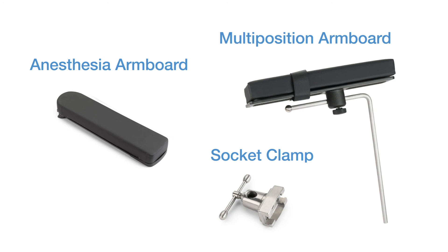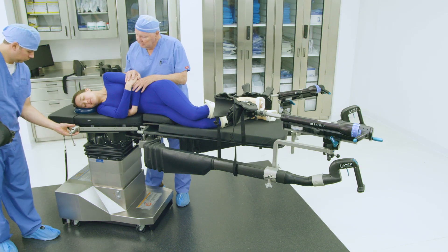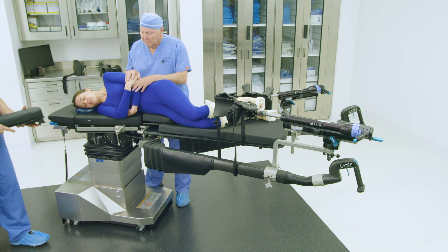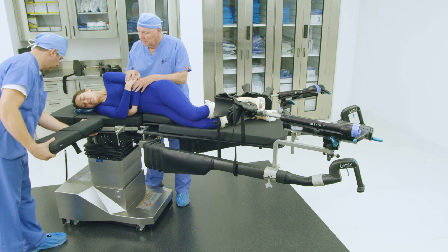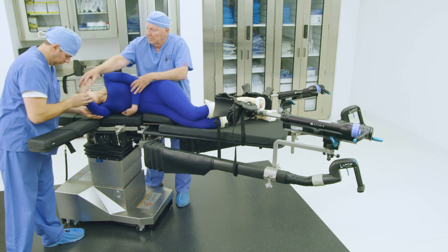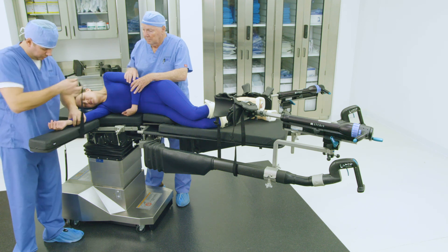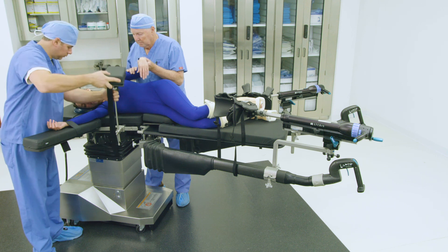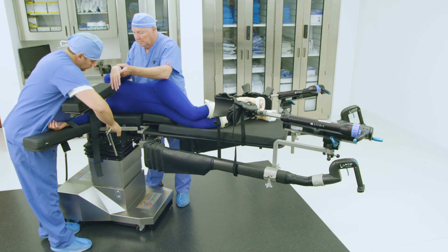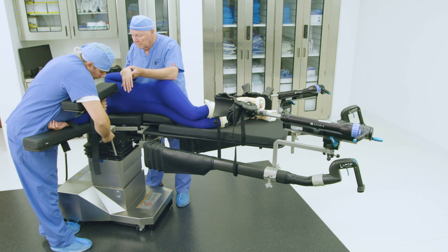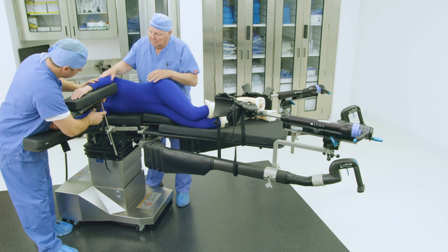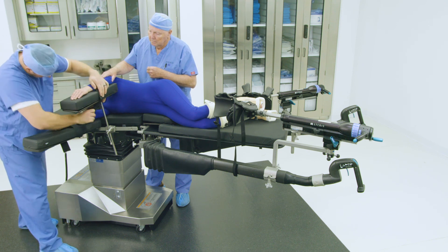Before attaching the anesthesia armboard, first apply a socket clamp to the side rail on the non-operative side of the table. Next, apply the standard anesthesia armboard to the side rail of the table on the non-operative side. Adjust as needed to accommodate proper arm position and apply the safety strap to secure the arm. Next, mount the multi-position armboard into the socket clamp. Adjust the height and position of the armboard above the patient's other arm, focusing on proper alignment and height positioning, and tighten the socket clamp to secure. Place the patient's operative side arm into the multi-position armboard and apply the safety strap to secure the arm.